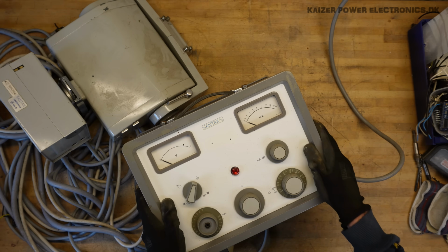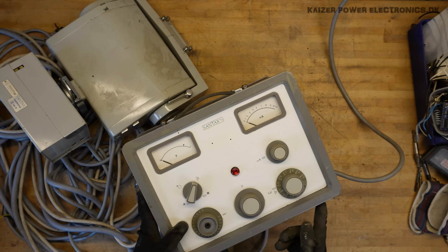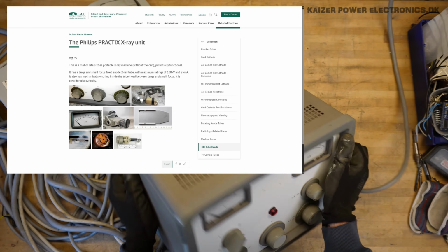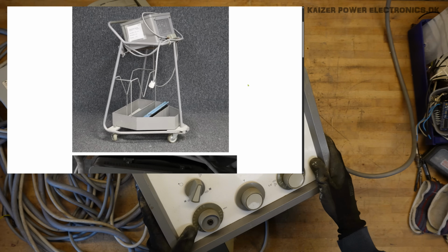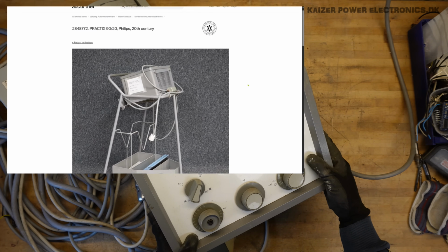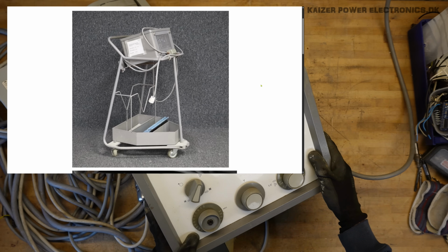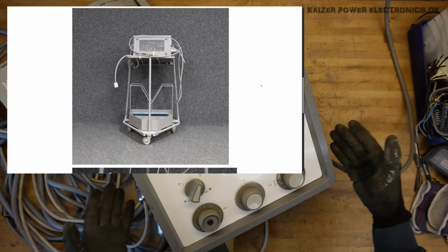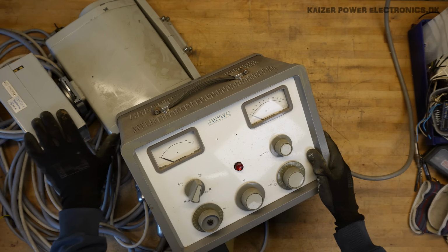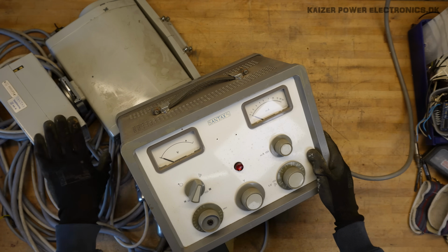But if we take a look at some websites I found with this system, we can see that the reason why it actually has feet underneath and also feet on the back here is because it's normally sitting on a trolley. So this is an old mobile system from the 1960s. So quite old. We expect to find maybe some old SCRs inside. I doubt it's tube technology, but we'll see. It could also be it's just mains driven, that is just simply switching on and off 400 volt AC up onto the head, and the whole high voltage power supply is just built in here.